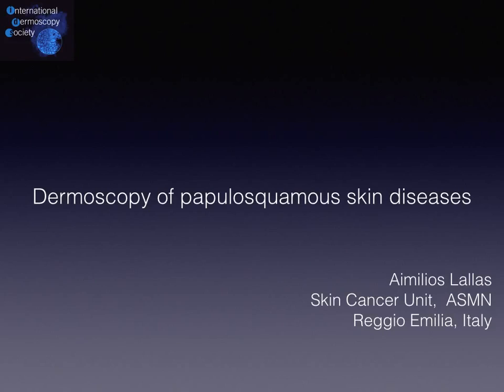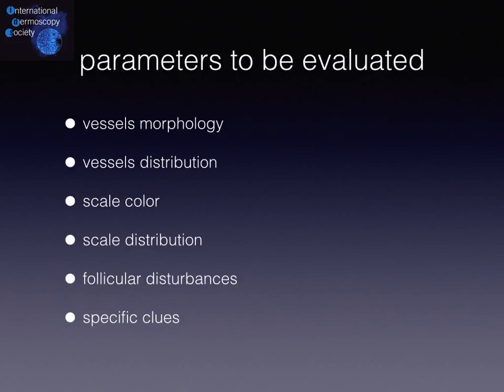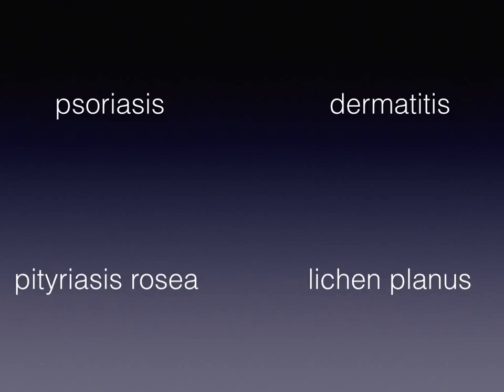Dear friends of Dermoscopy, welcome to this podcast, which will be the first among a series of podcasts focusing on the use of dermoscopy in general dermatology. In a previous podcast, we already analyzed the basic principles of inflammoscopy, meaning the parameters to be evaluated when applying dermoscopy in inflammatory skin diseases. In this podcast, we will focus mainly on papulosquamous dermatosis.